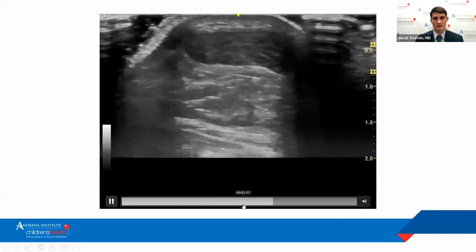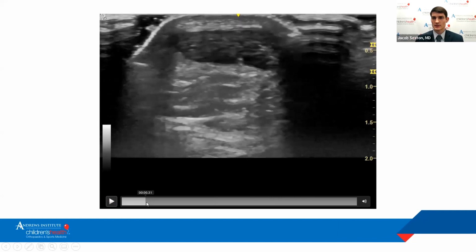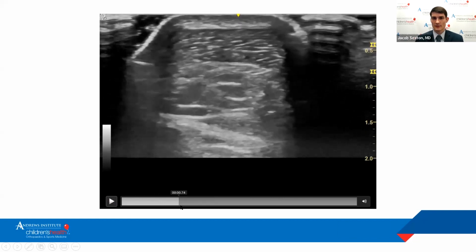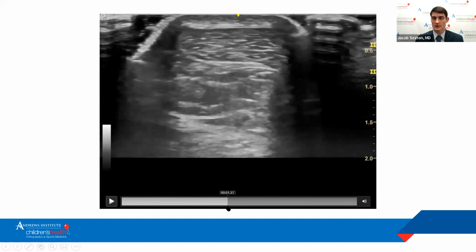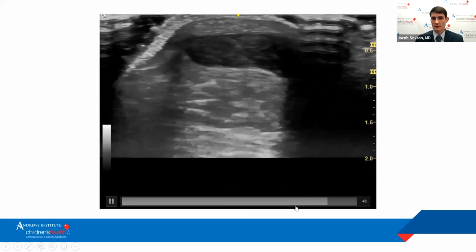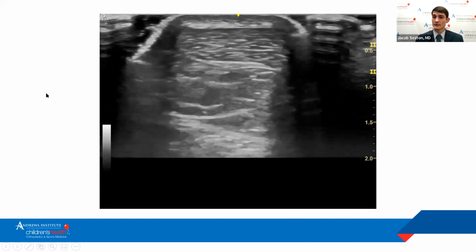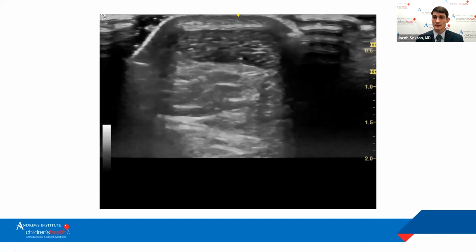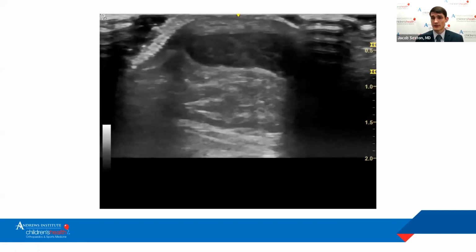So again, I'm going to show you a little bit. Again, got this hypoechoic area. And then as I continue to tilt the probe, I have correction of my anisotropy, with it being almost eliminated there and having a nice fibrillar pattern of the Achilles tendon. And then as the clip goes and I continue to tilt the probe further on, it then turns back into that hypoechoic area. And if you're not aware of anisotropy, it can make you think of a pathological lesion, just a strain or tear, when there's actually one not there.